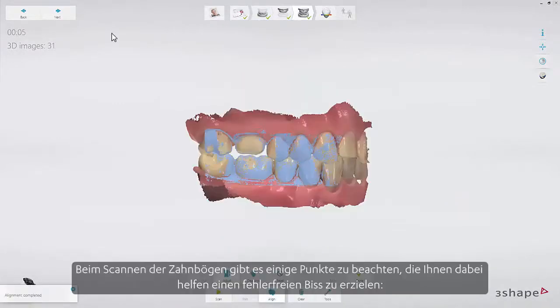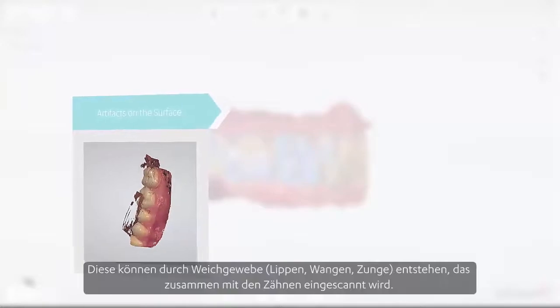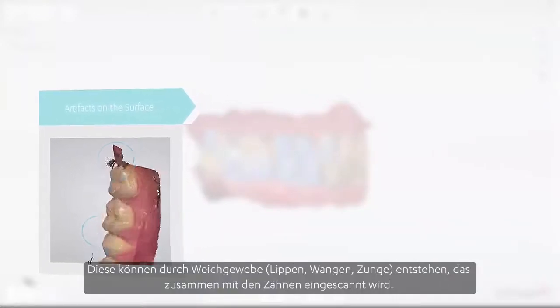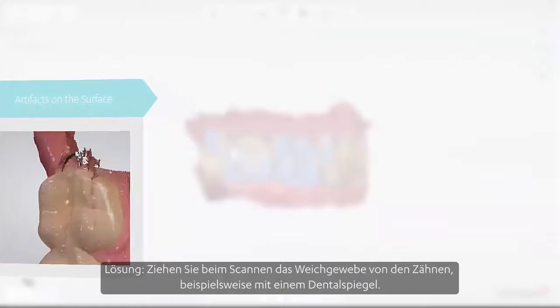When scanning the arches, there are a few things that will help you to obtain the correct bite. 1. Avoid artifacts on the molar surface. These may result from soft tissue, lips, cheek, tongue, being scanned onto the teeth. Fix: retract soft tissue from the teeth while scanning, using, for example, a dental mirror.